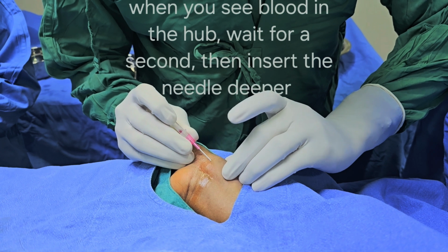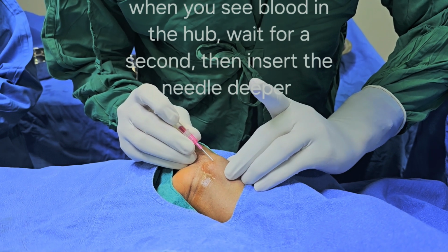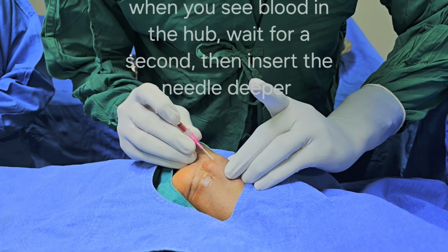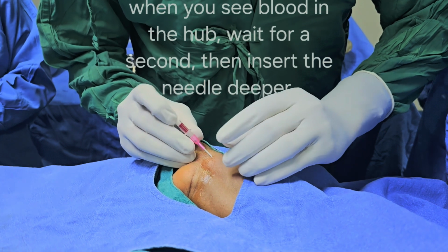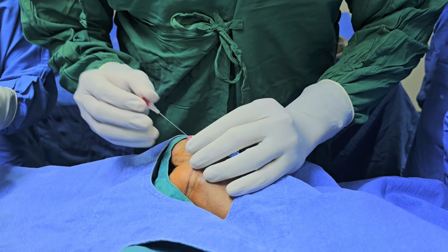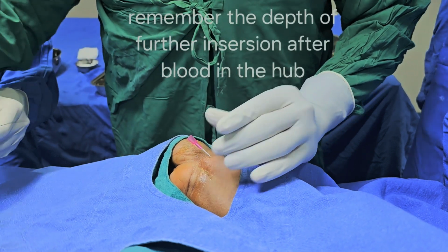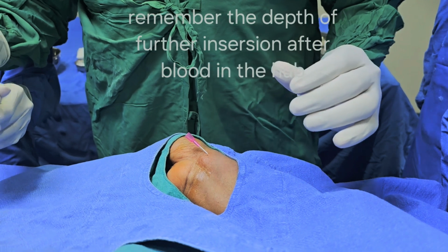If you have missed the radial artery, do not panic. Do not pull out the needle. Palpate the radial artery again, noting its position in relation to the direction of the needle. Pull back the needle and reinsert it. Once the hub is filled with blood, push the needle further in to a depth of 3 to 5 mm. Remember the depth of further insertion.